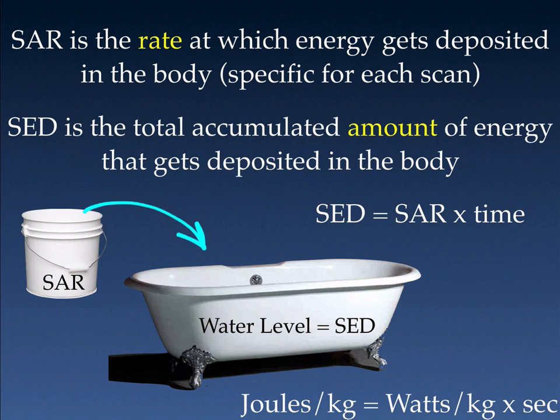So once again, SAR is the rate at which energy gets deposited into the body. It is specific for each scan, and it is estimated for each scan.